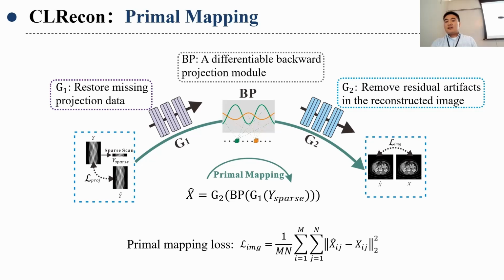In this study, the authors built an FBP algorithm based on PyTorch. Since this research is mainly based on simulation pairing data, the authors use the MSE loss for training.